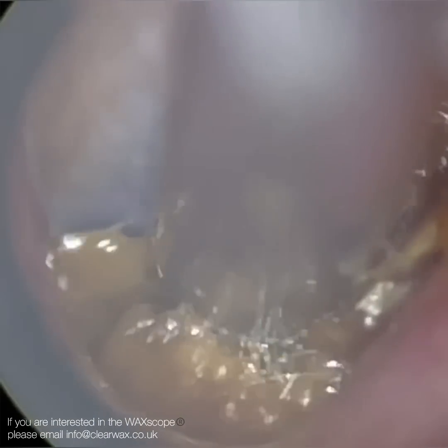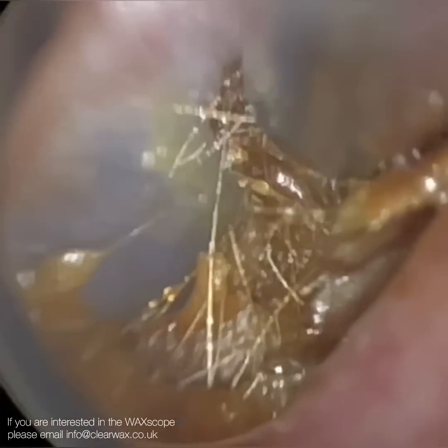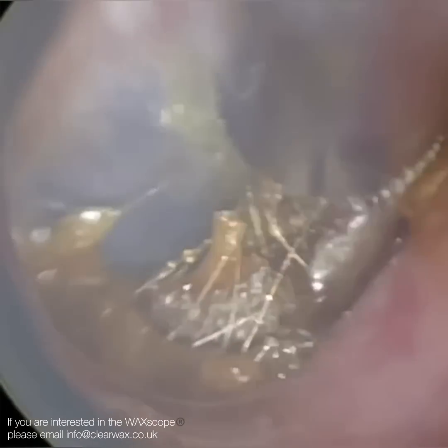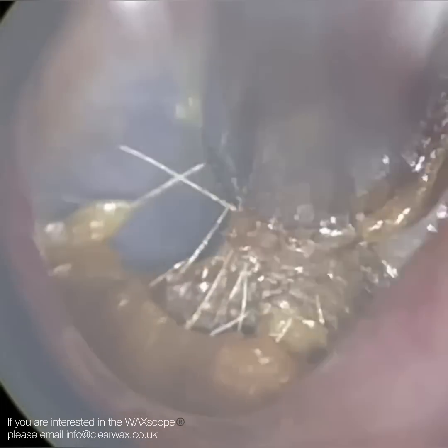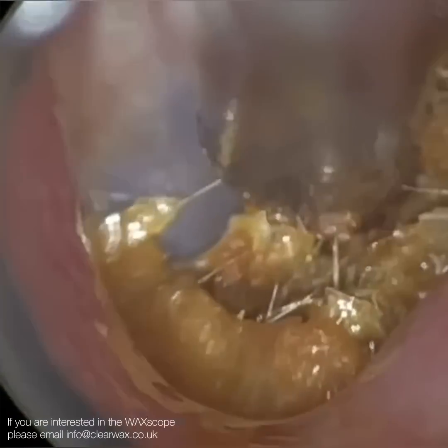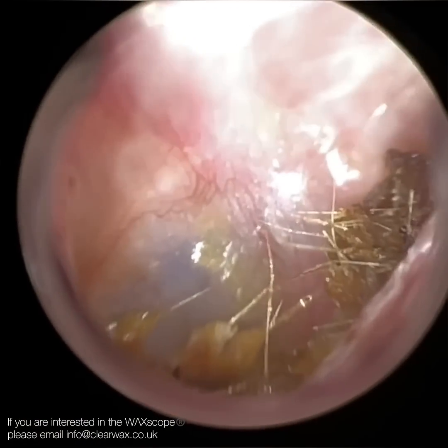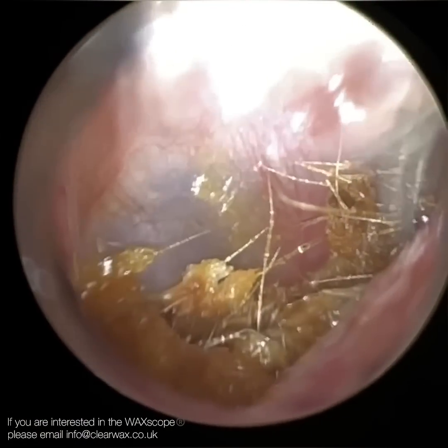I've zoomed in here — we're right on the eardrum now. This is the inferior recess; there's a little trench this patient has, and here's the anterior recess. I've got a good view, though that slight shadowing effect is just a few hairs at the entrance. I do manage to get a bit more out with the Waxscope, but in the end I just had to resort to the endoscope.